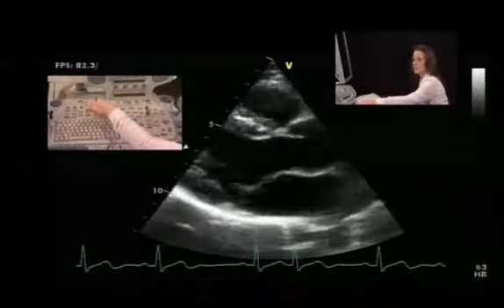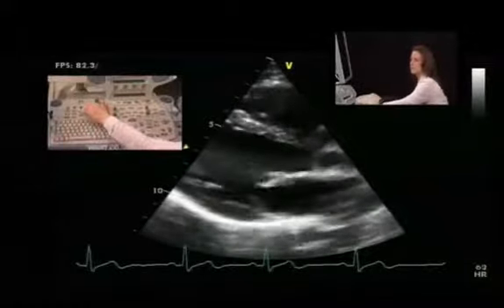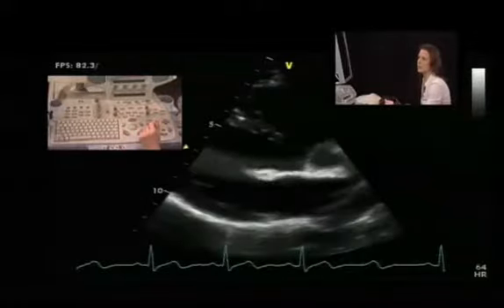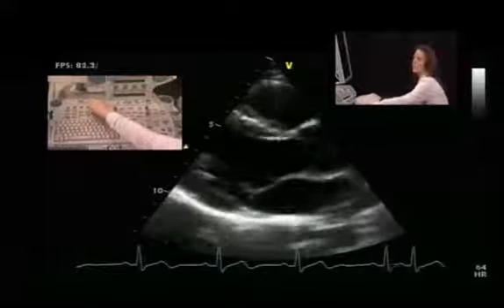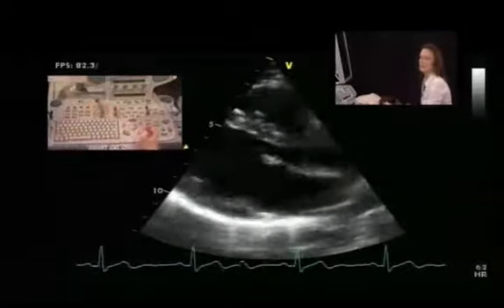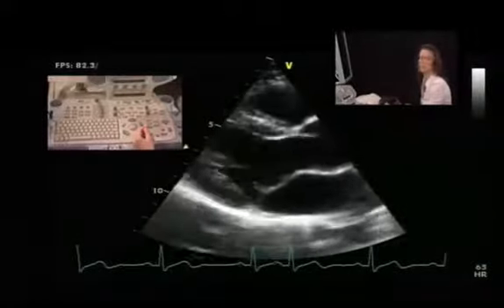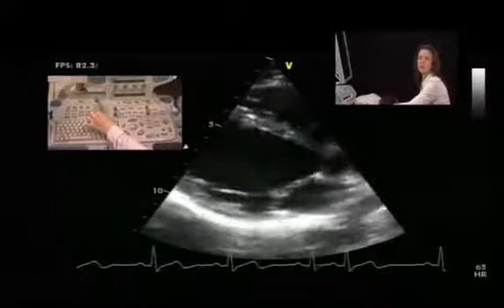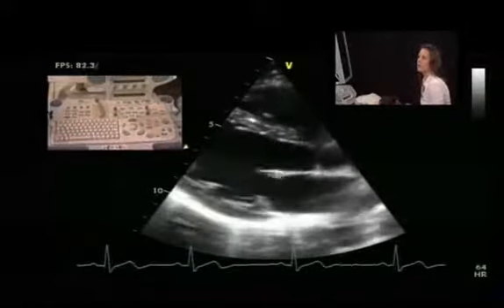I can show you just by taking one of these sliders and putting it to the maximum. Maybe move the others a little bit down, and you see you have a bright spot just in the middle. So what is it good for? You may have an image where you have the impression that you need just a little bit more gain, for example in the depth, here for the posterior wall. Then you just take this area and give a little bit more gain instead of over-gaining the rest of the image. So you can really focus on the area where you need just a little bit more or less gain and adjust it.